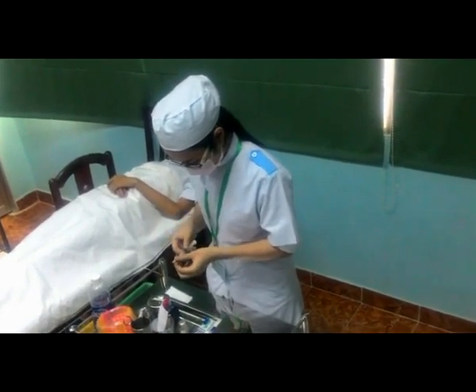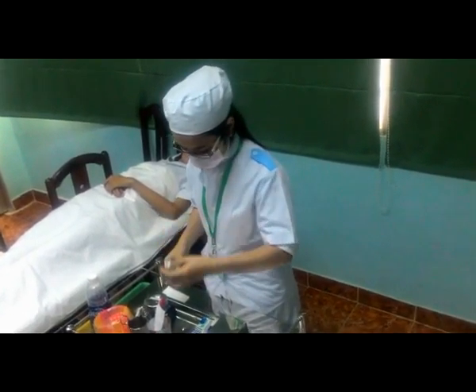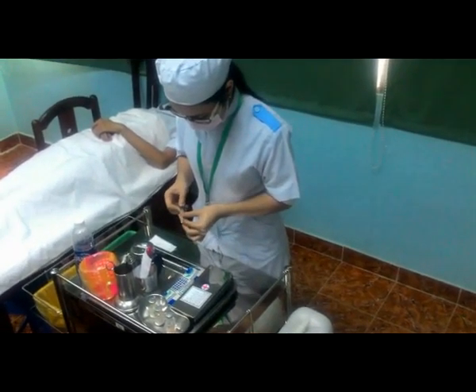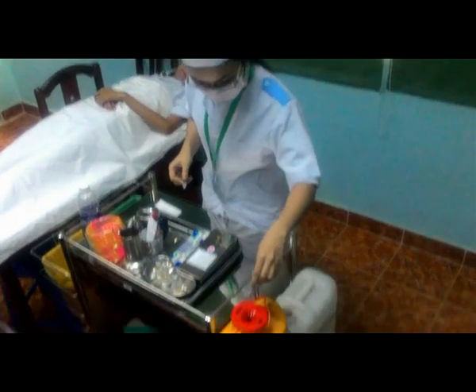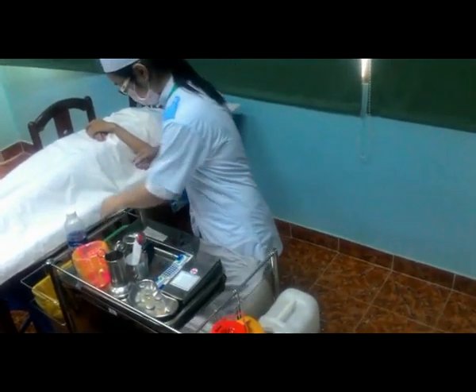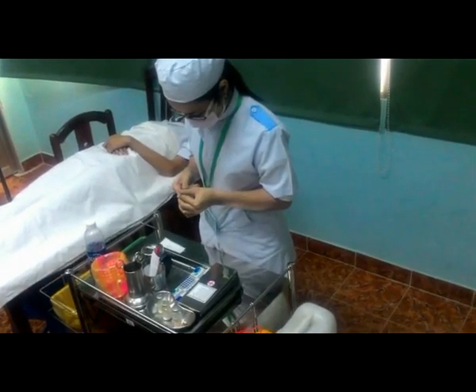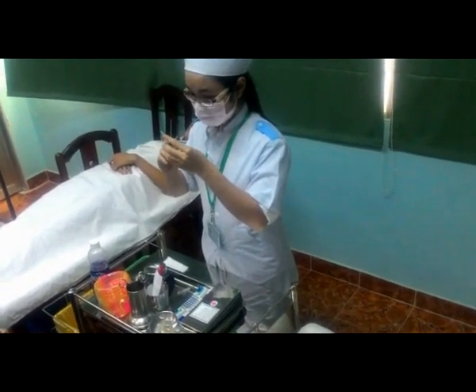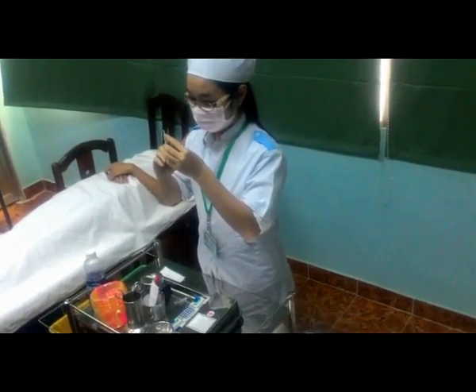Đọc nhãn thuốc. Thay kim pha bằng kim tiêm. Đuổi khí đúng cách, lưu ý tránh mất thuốc.